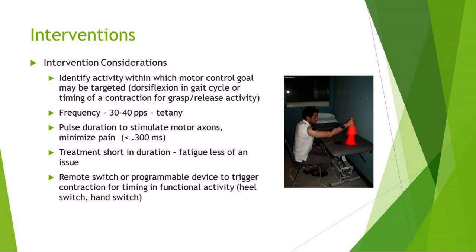The treatment has to be short in duration. Fatigue is usually less of an issue because we're doing a functional activity. You don't do a functional activity till you drop most of the time. You just do it till you get it done. And a lot of these devices have a remote switch or a programmable device to trigger the contraction for timing in a functional activity, like a heel switch or a hand switch.